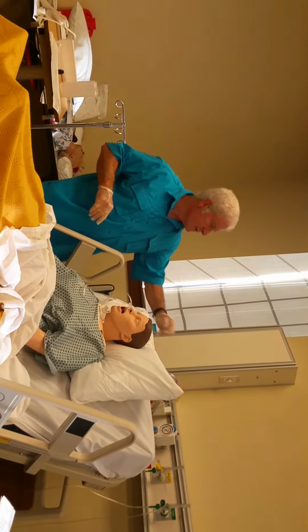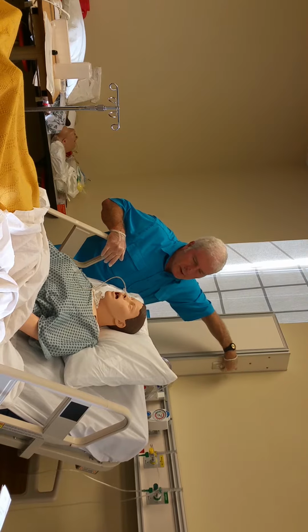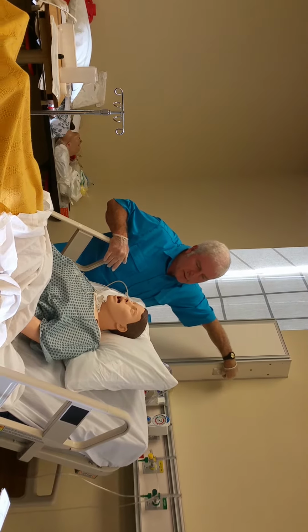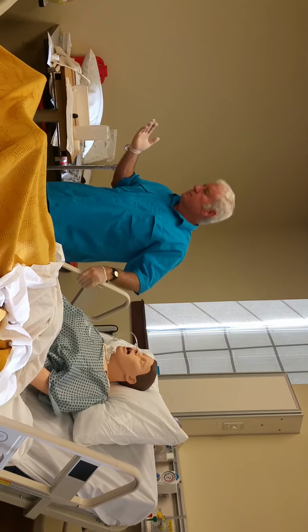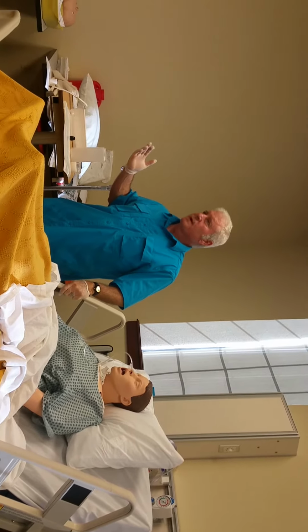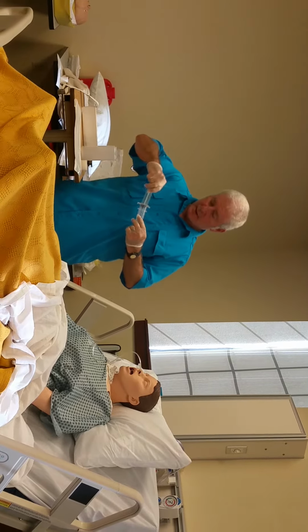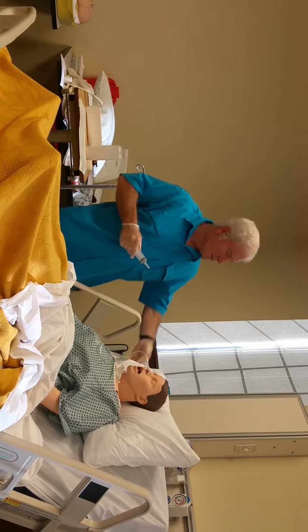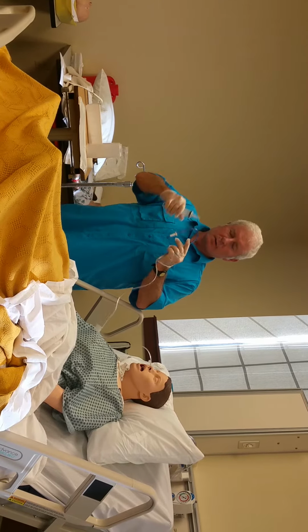Once you get it, he's not on suction anymore, but he can't eat. And he's on regular feedings, okay? So every 4 hours we have to feed him. What you do is, the first thing, and don't forget this is very important. The first thing you do before he eats is called aspirating.